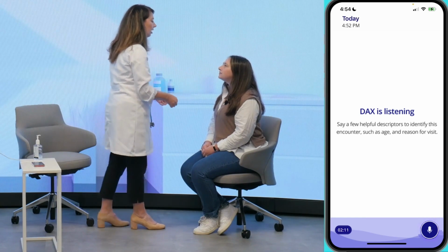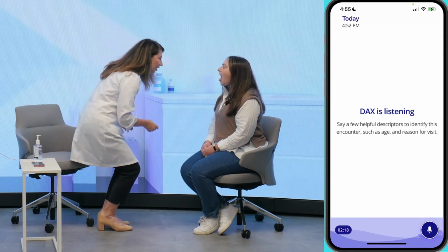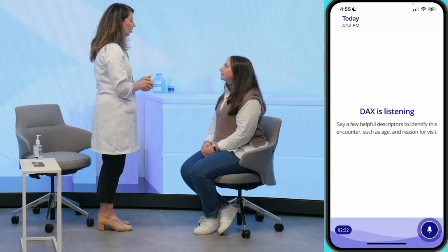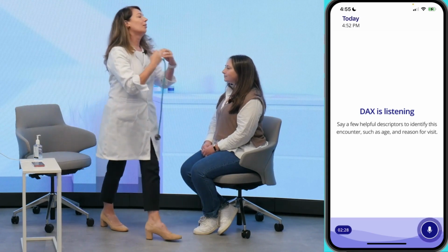Okay. All right. On facial examination, there's mild pain to palpation of the frontal sinuses bilaterally. Just going to look in your throat. Okay. On throat exam, the uvula is midline. No evidence of any peritonsillar exudate. On neck examination, there's no cervical adenopathy present.